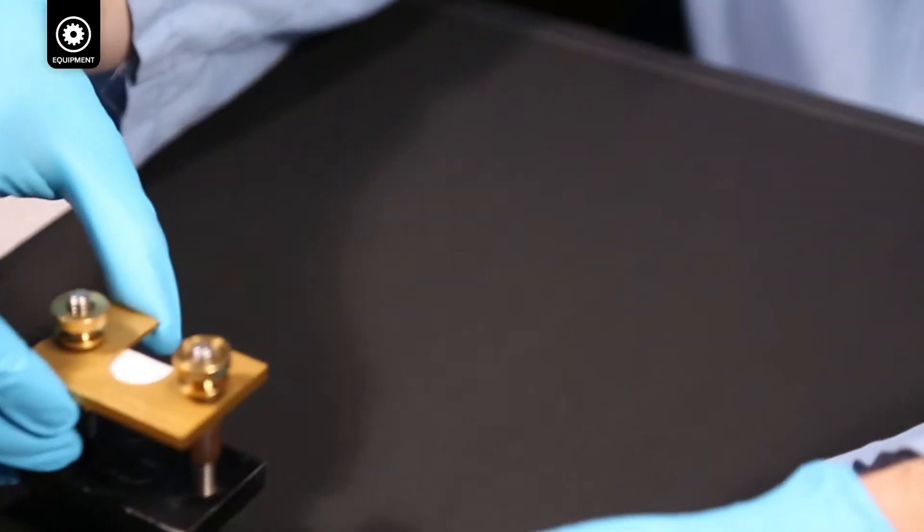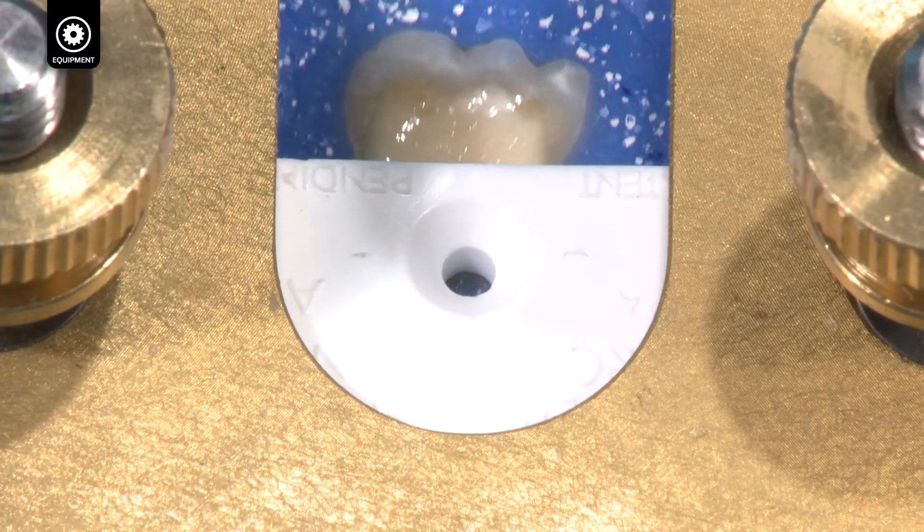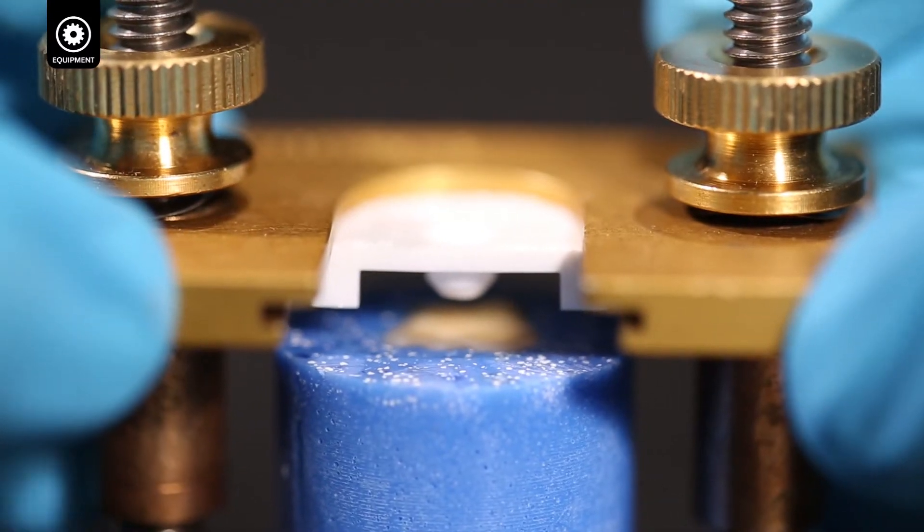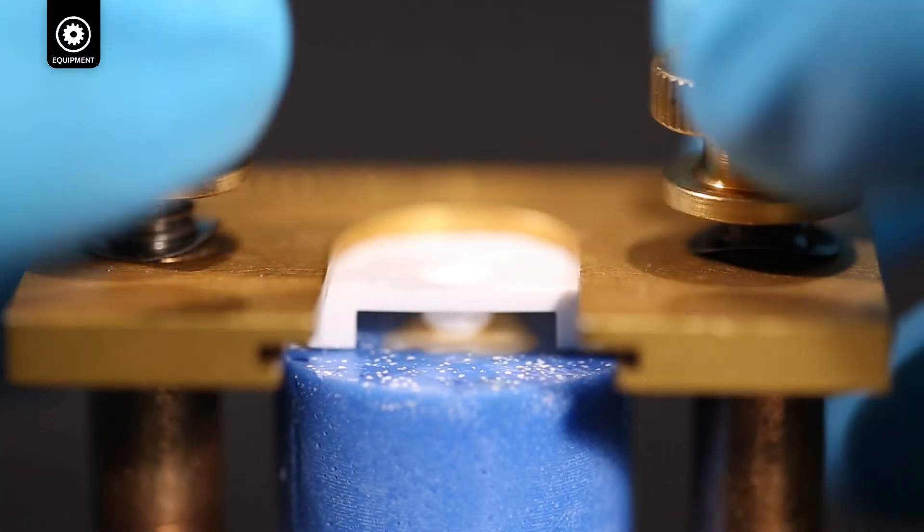Place the specimen into the bonding clamp, with the mold centered directly over the dentin of the tooth. Gently tighten the thumb nuts until they lightly press onto the springs.